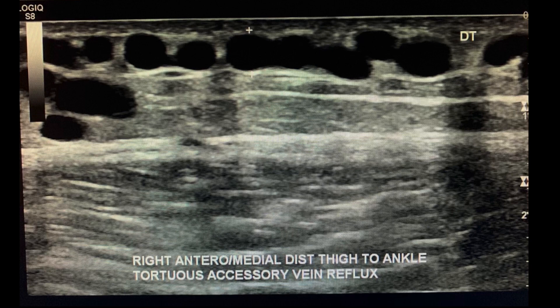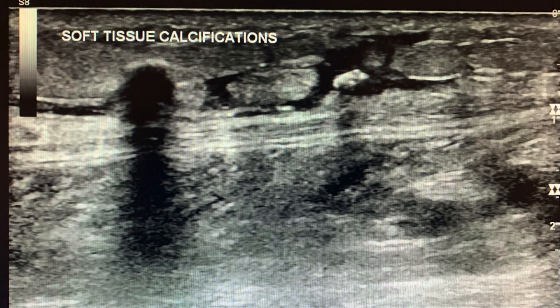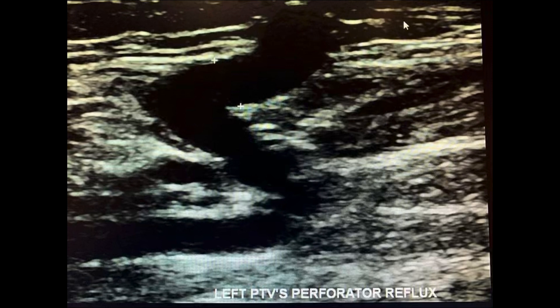Next, go on to the posterior calf and scan any obvious varicose veins or perforators. Measure the diameter. Take grayscale and colored Doppler images and spectral Doppler to assess for venous insufficiency. While you're scanning, always be sure to observe the patient's soft tissues to look for edema, which is usually a cobblestone appearance with fluid in between the fat. Also look for any perforator veins that may be dilated and assess for reflux.